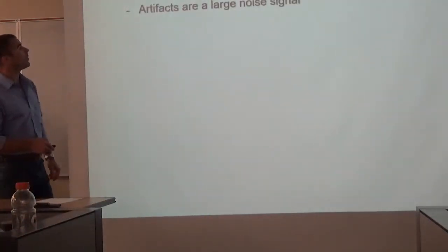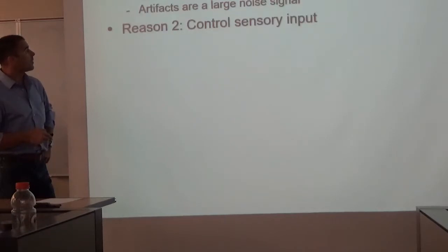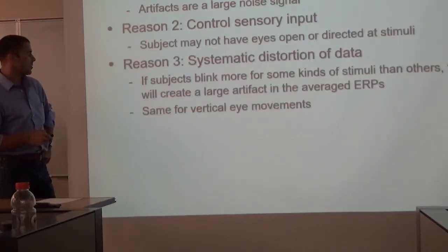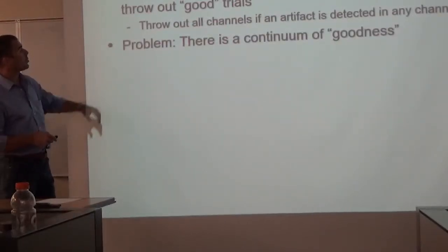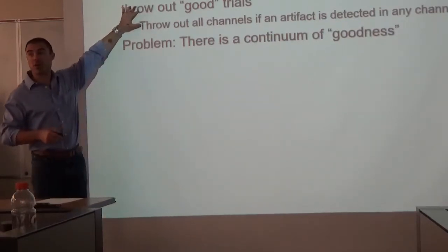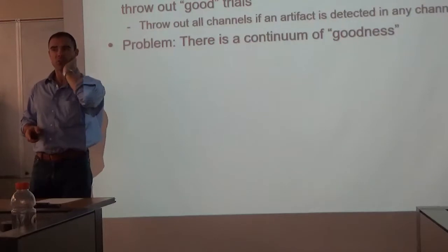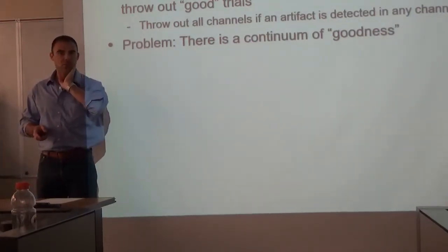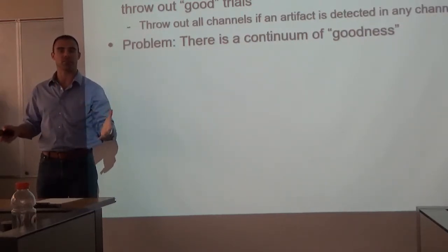So we talked about rejecting artifacts as one way that we can do that. Okay. And let's see here. I'm going to skip through a couple points on this slide because we've already covered it. We're not going to get more depth on it. And so the trick here, when we're talking about artifact rejection, okay? Remember last class we talked about throwing the baby out with the bathwater? Right? You have this problem. You've got bad stuff in the data. You've got these artifacts there.